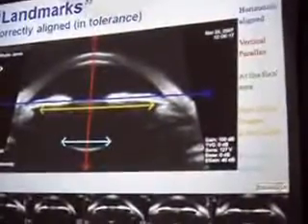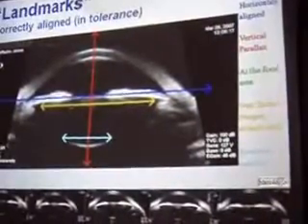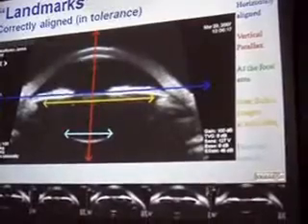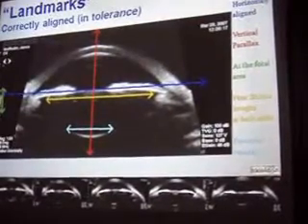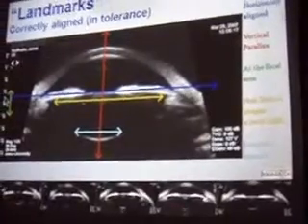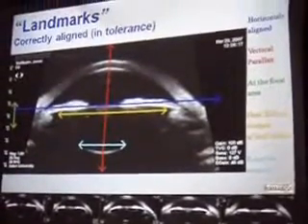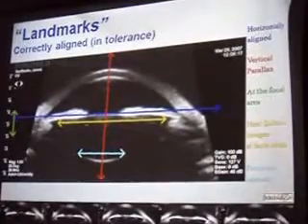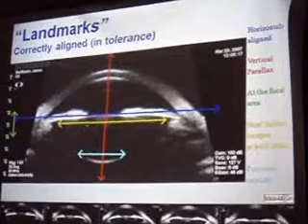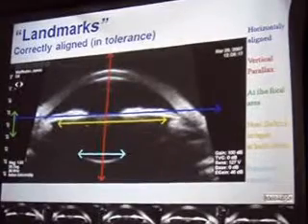The iris plane horizontally balanced between 10 plus minus 1, which is the reference we have here on the left, and 12 plus minus 1, which is the focus area of the equipment. The equipment provides you a focus distance plus minus 1. You must place the area to be measured inside this strip.